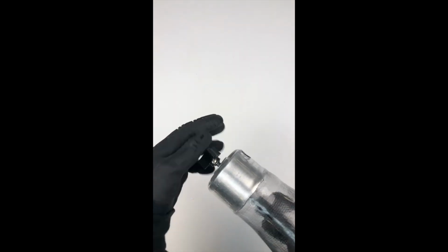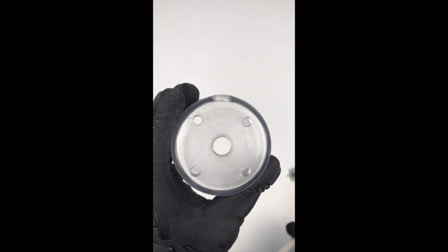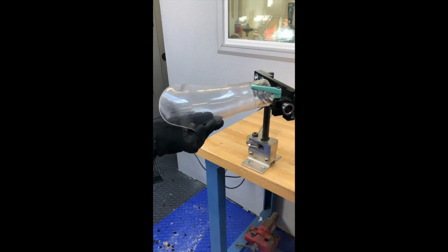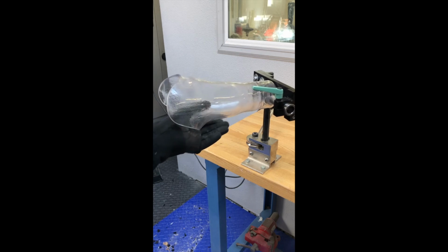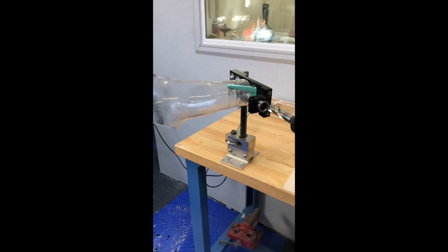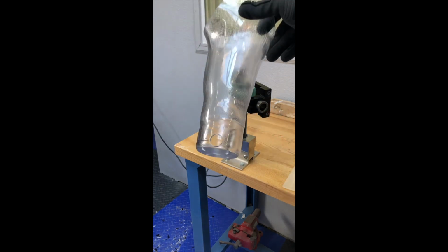Once all 4 holes have been drilled out, simply remove the tool and confirm the orientation of your 4-hole pattern. As with the 4-hole pattern in the distal end of the socket, a side hole jig can also be used to establish a perfectly centered side hole for the charge port for both the smart puck and the air puck valve.